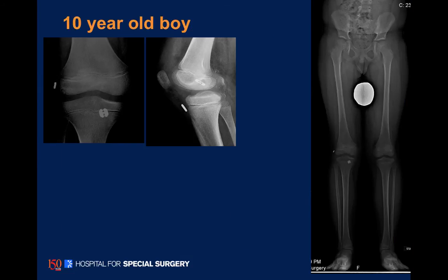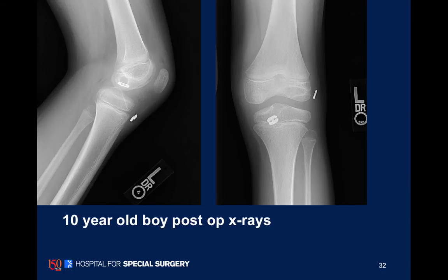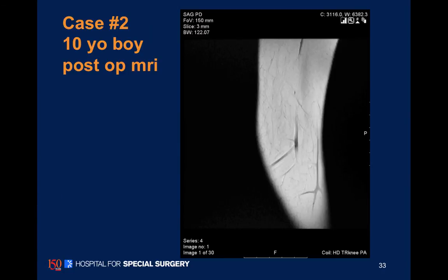Here's what our typical x-ray looks like — this is a 10-year-old boy — with the femoral and tibial fixation. Here's the MRI of that same child, three consecutive sagittal slices. This is to focus your eye on the tibial socket: you can see how the socket just stops close to the growth plate.